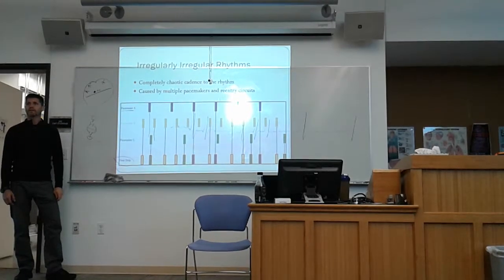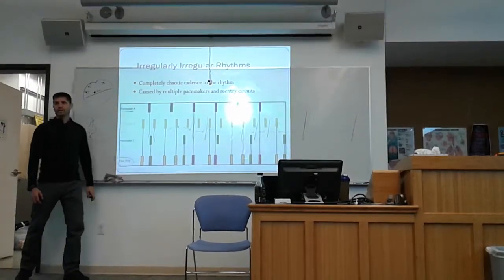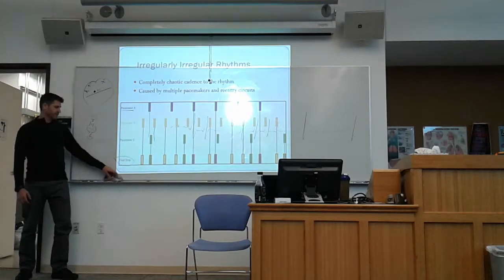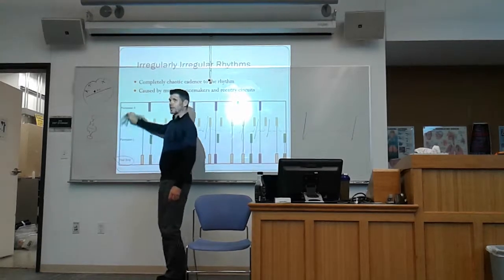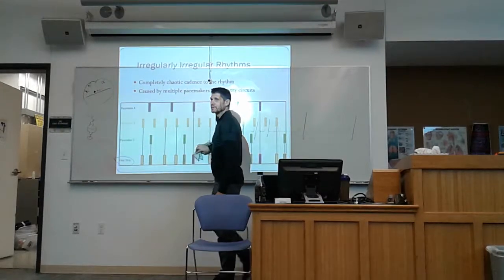You will be able to figure that out. This would be an example of what I just drew right there. You will be able to tell the difference shortly. Not yet, just because we haven't talked about it. But by the end of today, you will.